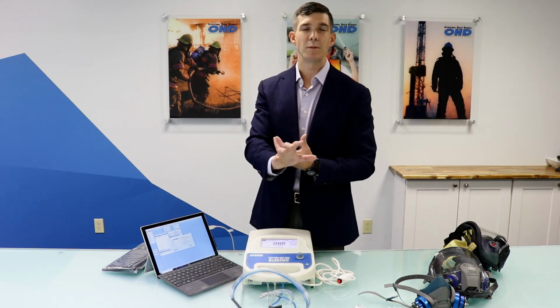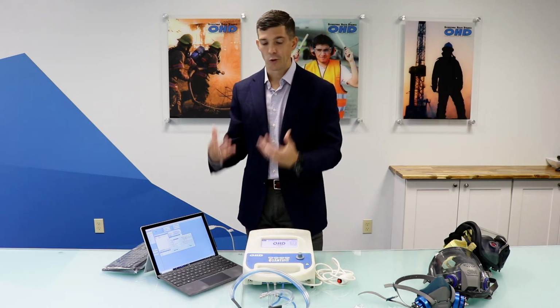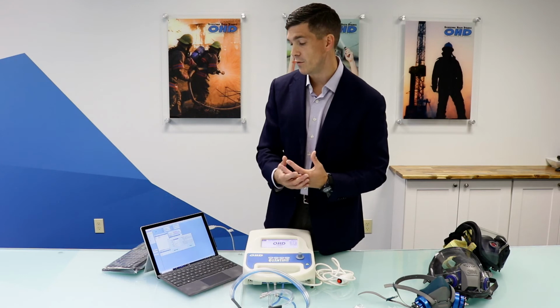So the nice thing about this home screen is you don't have to get into deep screens just to get started with testing, which is what most people need to do. Normally when you're working with the machine, you're needing to do fit testing. So this gives you the chance to jump straight into fit testing, find your personnel, add them in and do testing.